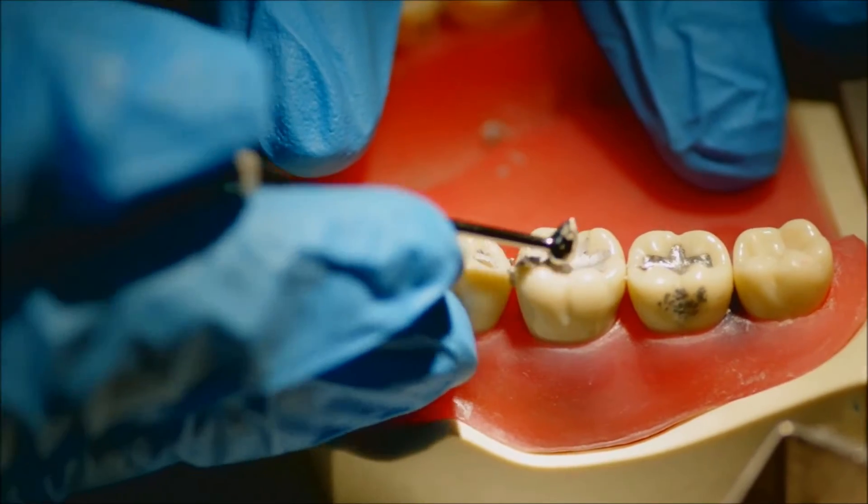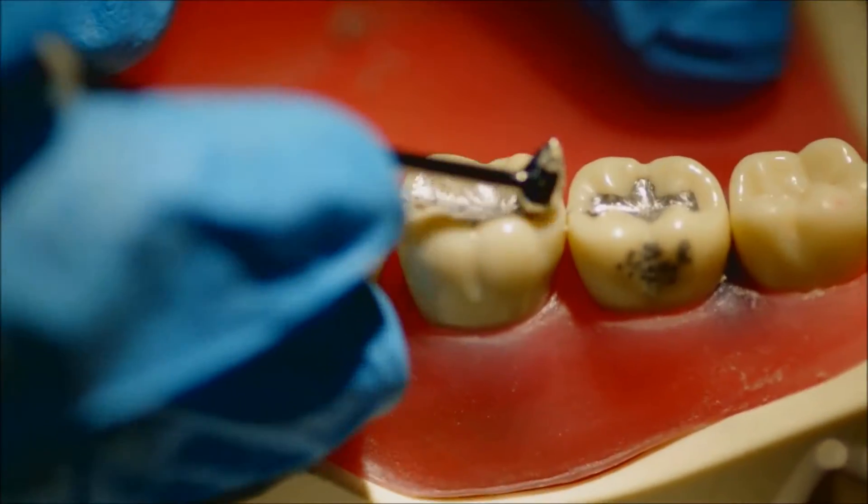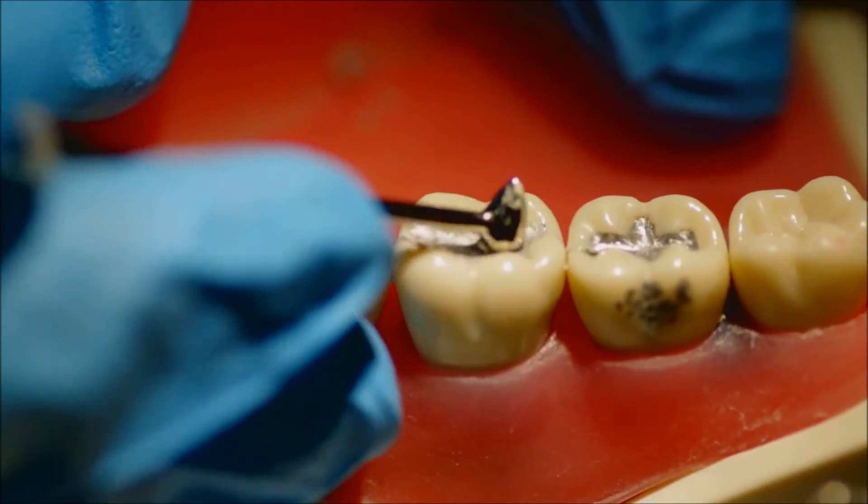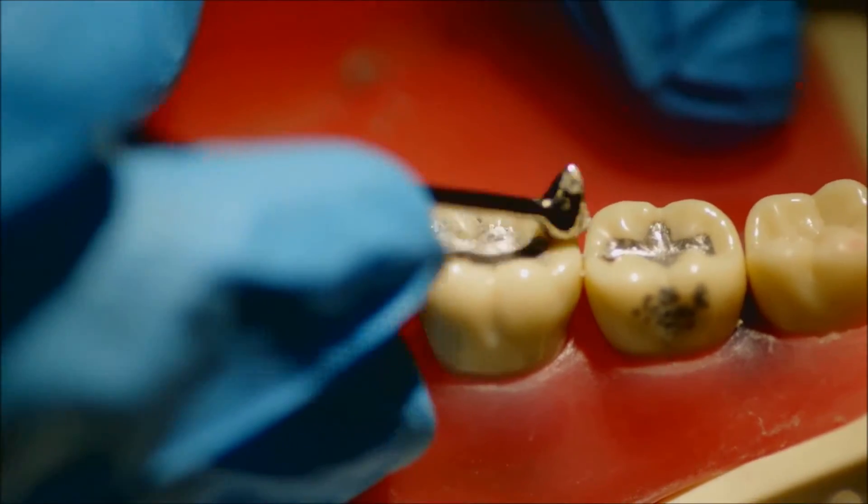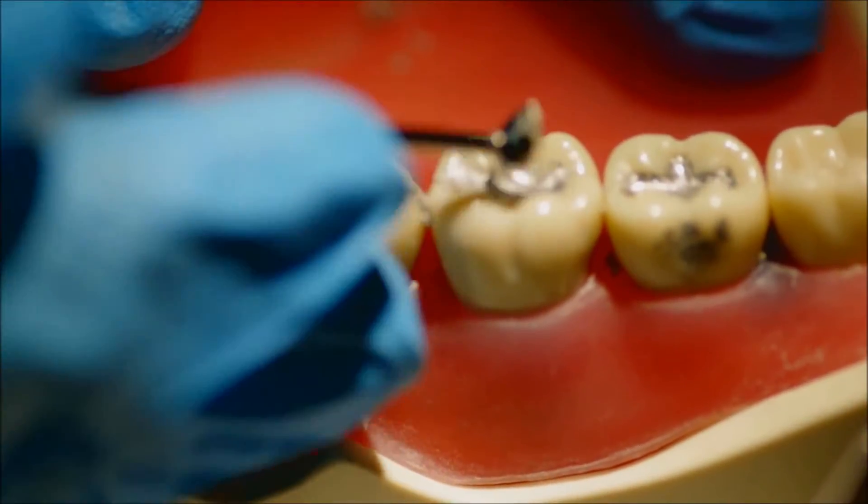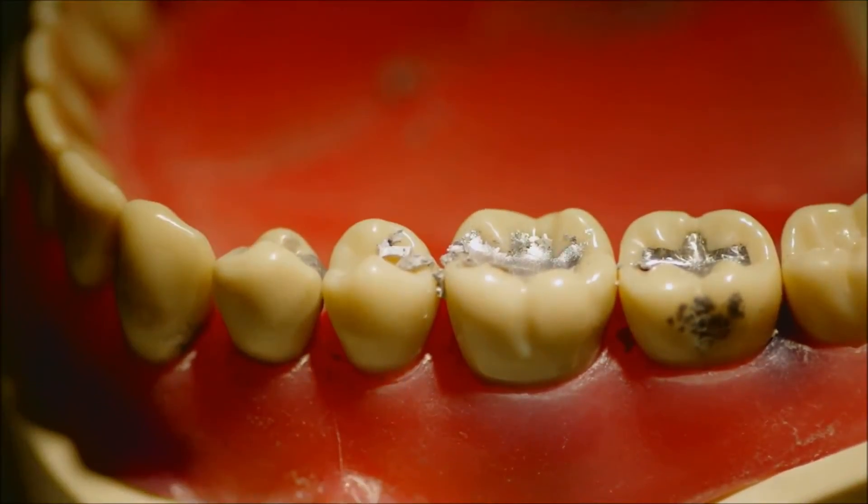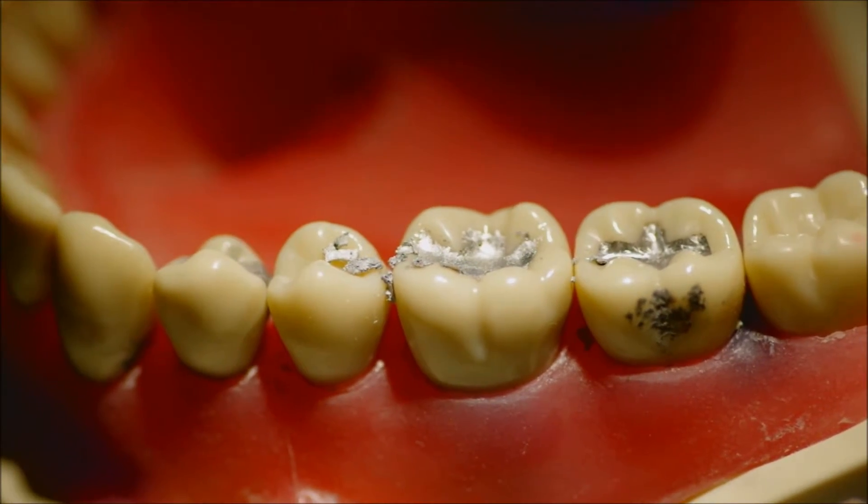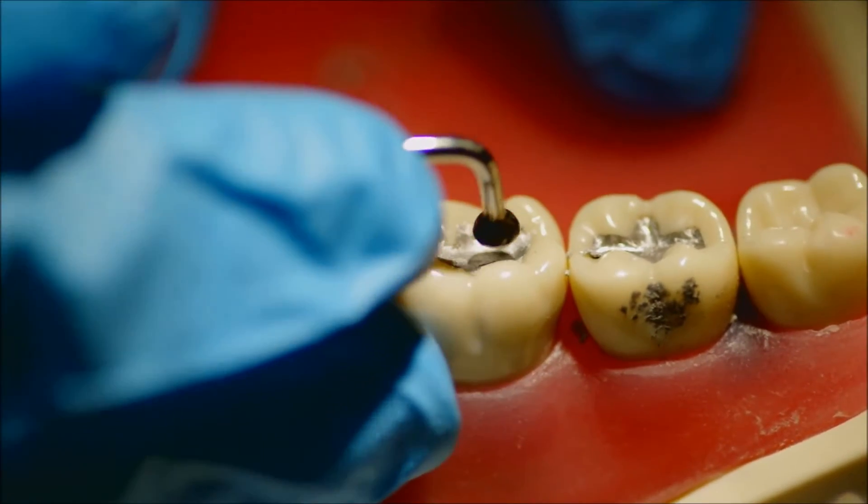I'm now using the wide side of the egg ball burnisher or the football burnisher, and what I'm using this for is to create some elementary anatomy. Where I need a concavity, I create a concavity.